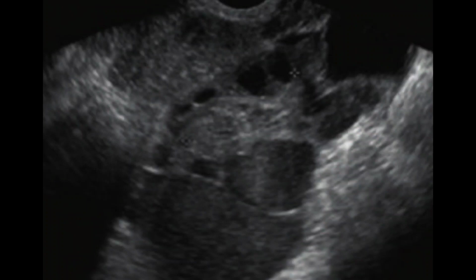So this is, I would say, a moderate degree of pelvic inflammatory disease, because the fallopian tube is dilated and the ovary is also enlarged. As a result, because of adhesion, they are both united to present as a complex mass. What you need to do here is mention that in the view, the right ovary and the right fallopian tube are inflamed, enlarged in size, and adherent to each other, presenting as a complex mass. So this would be considered a tubo-ovarian complex mass.